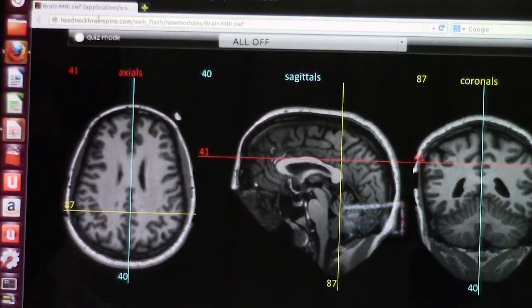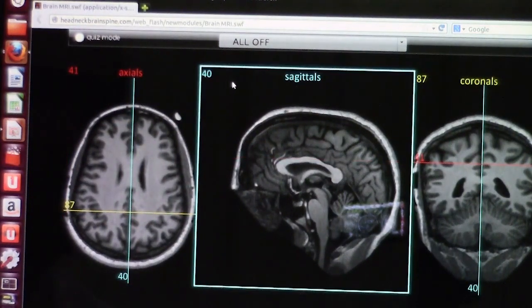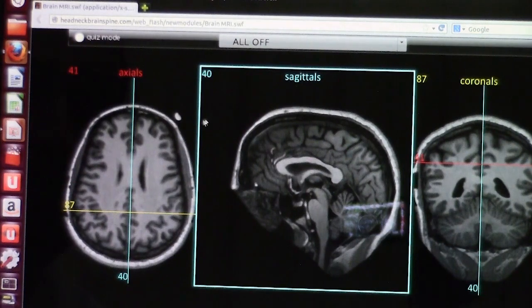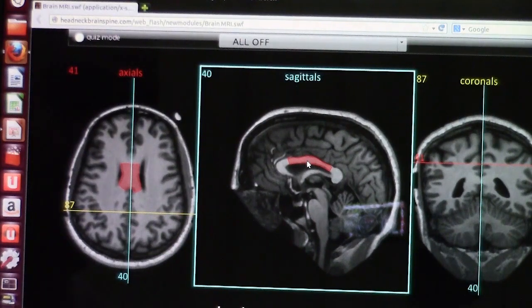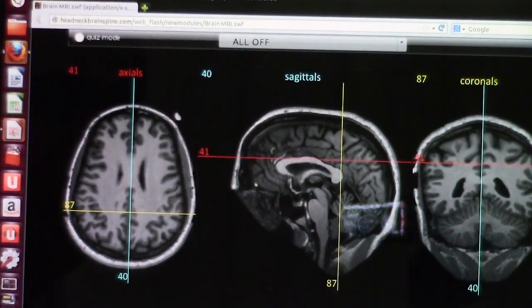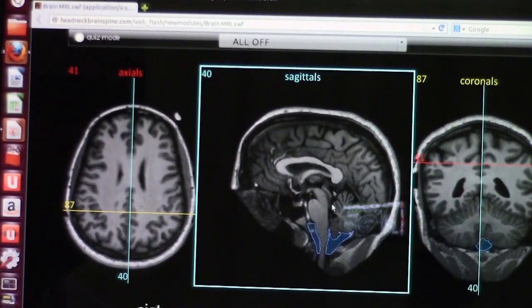This website, headneckbrainspineMRI.com, is extremely helpful as it has brain modules or neuromodules where you can point to a structure and it will tell you at the bottom what that structure is. Here I am pointing to the corpus callosum, and at the bottom it confirms it is the corpus callosum.